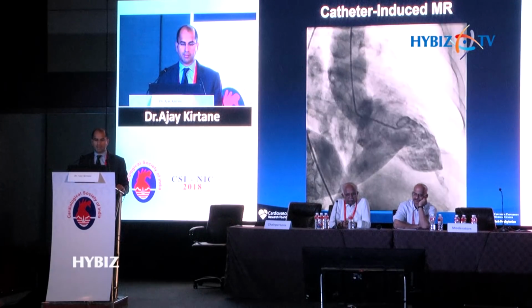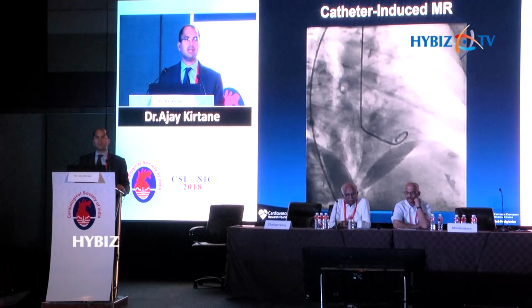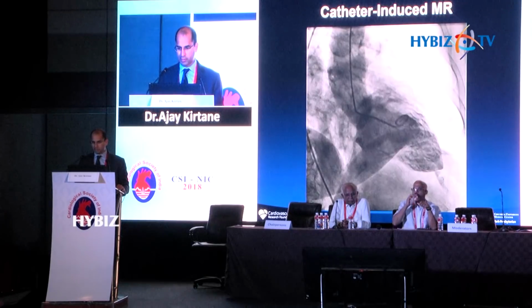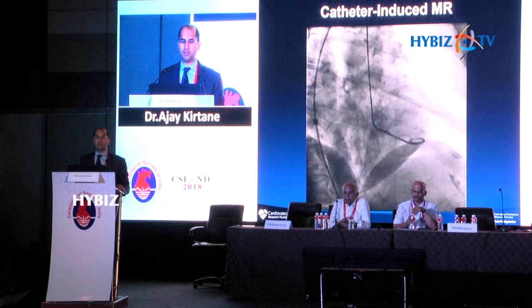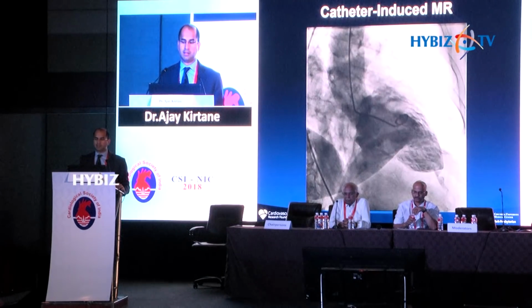This is an example of catheter-induced MR. You might call severe MR on the basis of this, but this was because of catheter position. You can see that you're hung up in the mitral apparatus here. The final thing I will mention is if you're going to do left ventriculography, you want to do it with side hole catheters and typically a pigtail type of catheter.